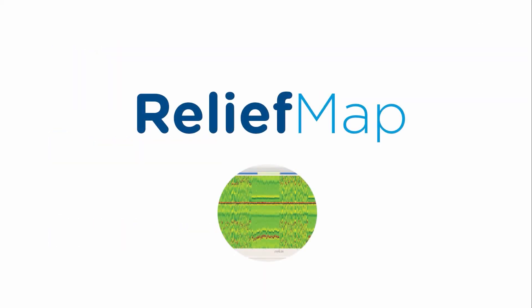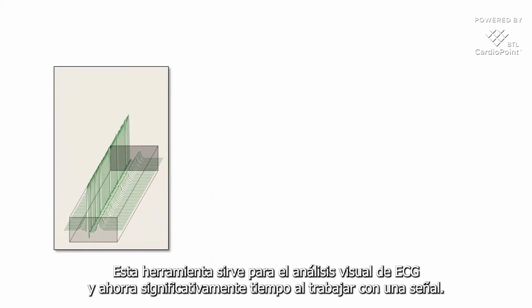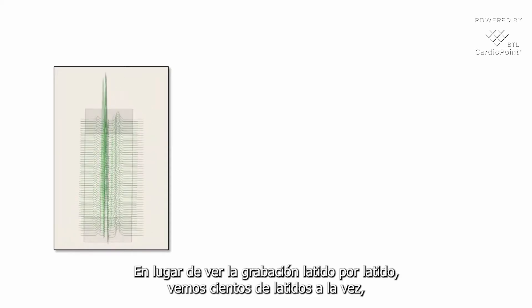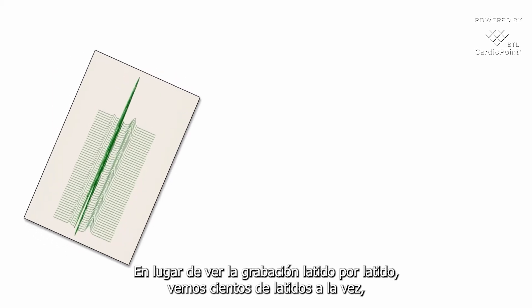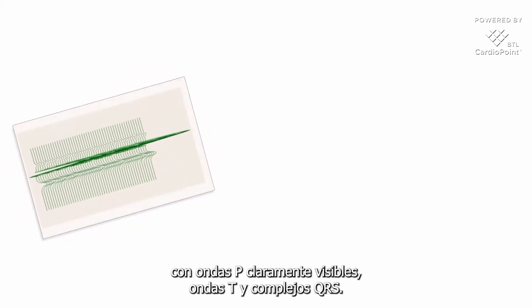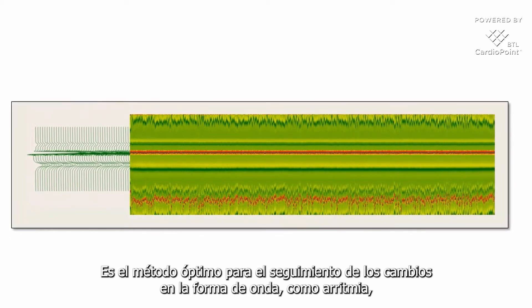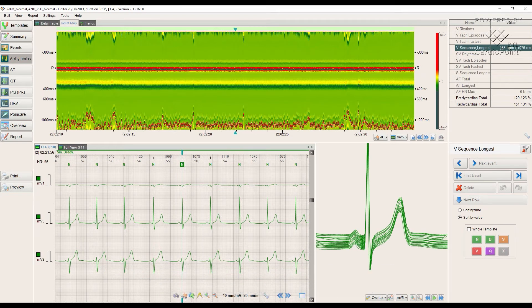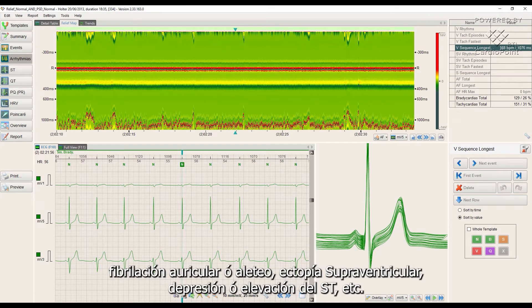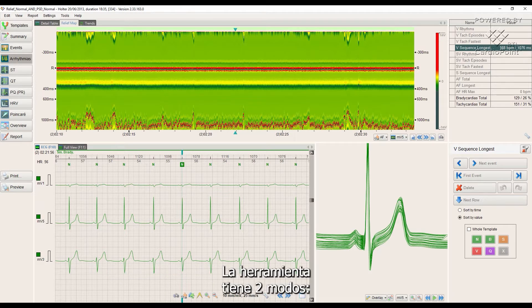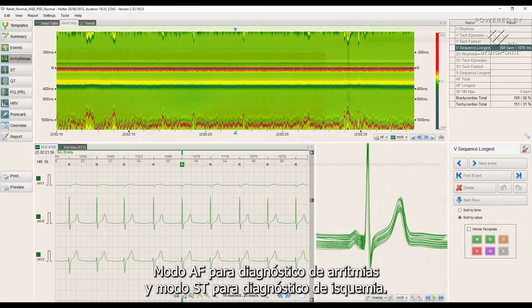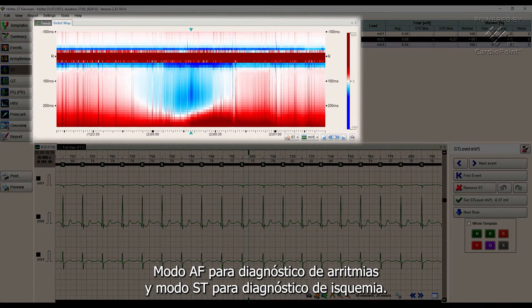Let's start with the Relief Map. This tool serves for visual ECG analysis and significantly saves time when working with a signal. Instead of reviewing the recording beat by beat, we see hundreds of beats at once with clearly visible P waves, T waves, and QRS complexes. It is the optimal method for tracking waveform changes such as arrhythmia, atrial fibrillation or flutter, and ST depression or elevation. The tool has two modes: AF mode for arrhythmia diagnostics and ST mode for ischemia diagnostics.